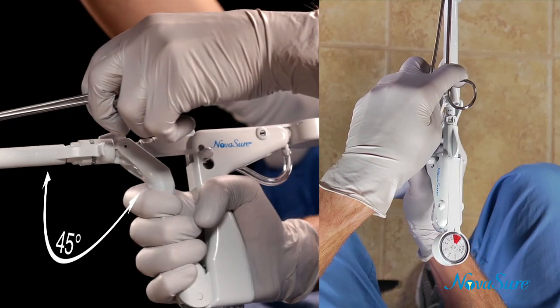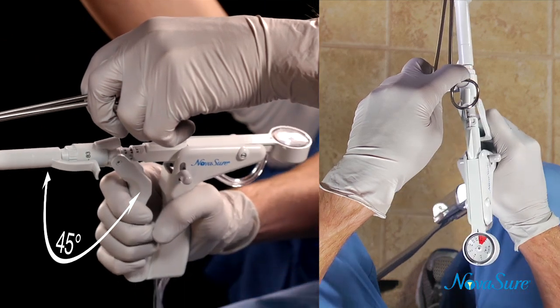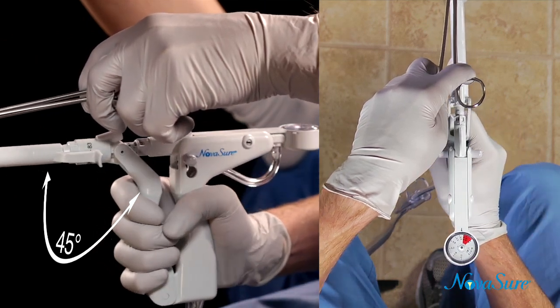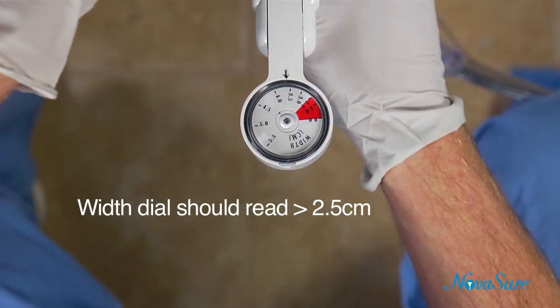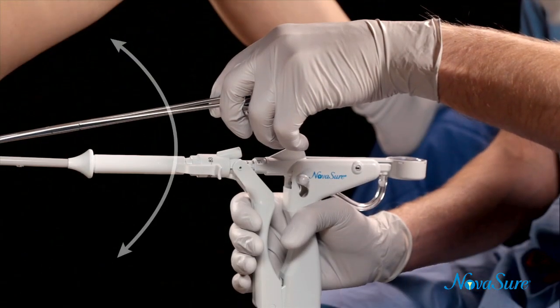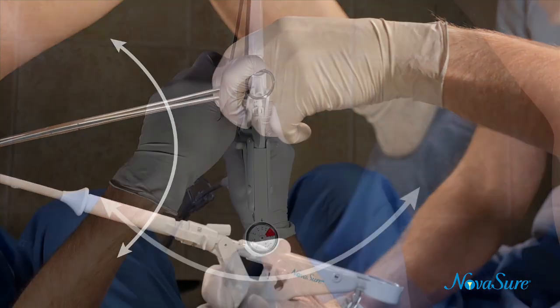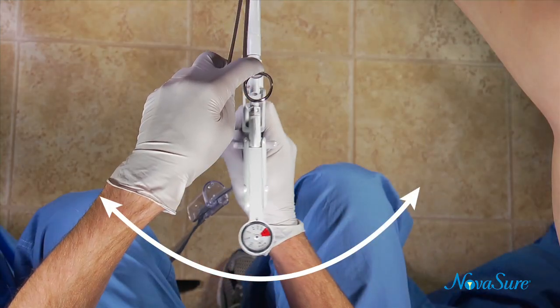Then gently rotate the handle of the disposable device 45 degrees left and right until the handles lock. The width dial should read greater than 2.5 cm. Once locked, gently move the disposable device using anterior, posterior, and lateral movements to the left and right.